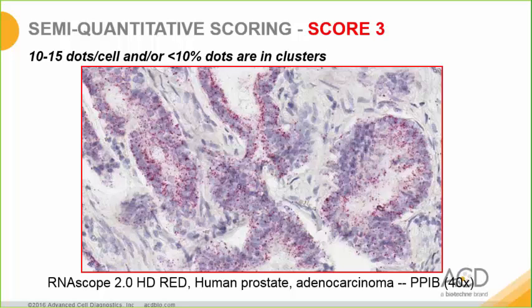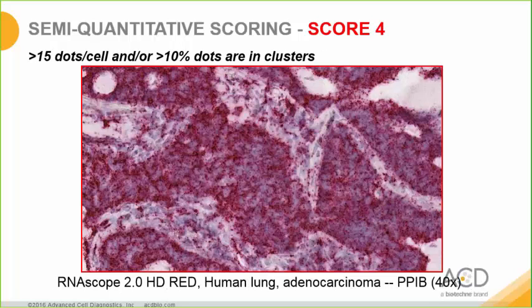In this sample, most of the cells, notably in the tumor cell compartment, contain from 10 to 15 red dots, thus getting a score of 3. In this sample, most of the cells contain more than 15 red dots, more than 10% of which are in clusters, thus getting a score of 4.